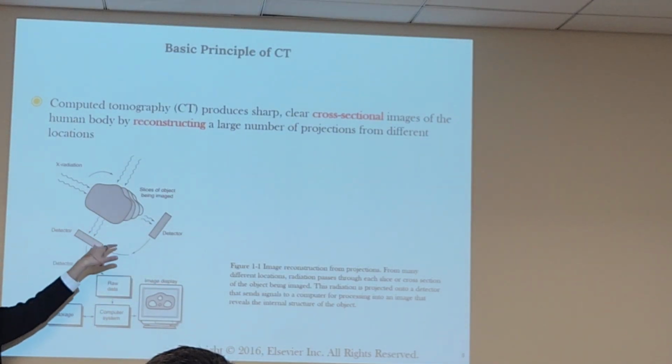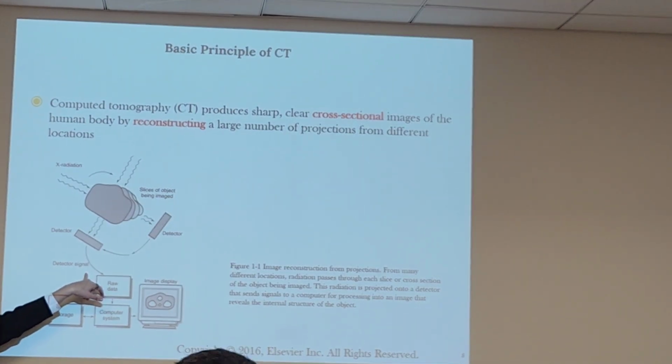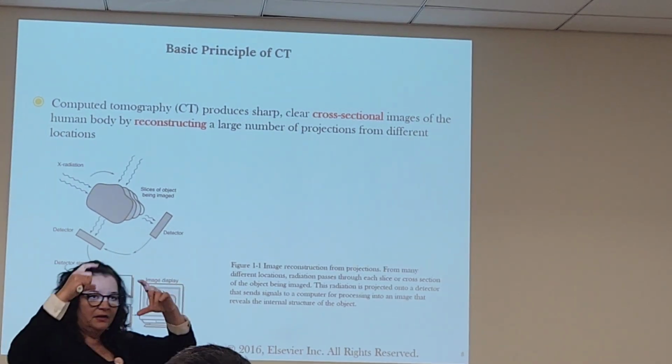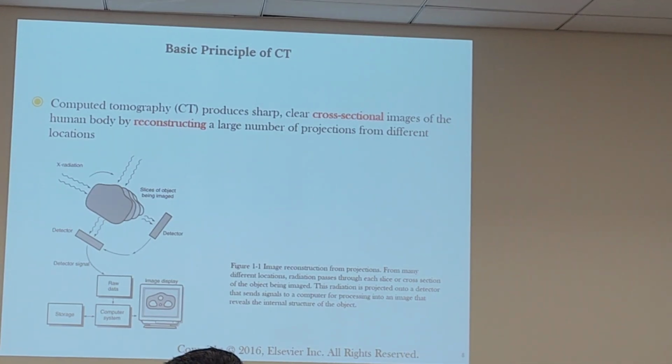That detector is now going to eventually cause some conversion, and we're going to get into the specifics, but I really want to say what is an overview of CT is the three-step process. We talked about what is a tomograph. Tomograph is a slice, that's where it originated with, slicing type of imaging. Then we talked about Hounsfield, we talked about Cormack, right?